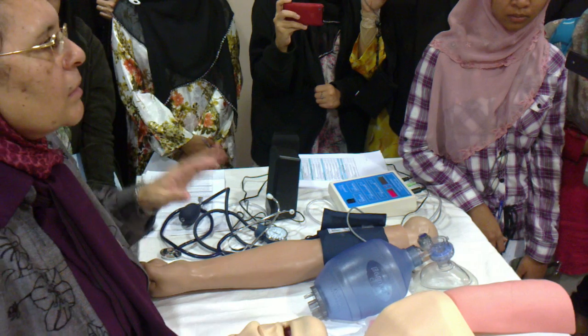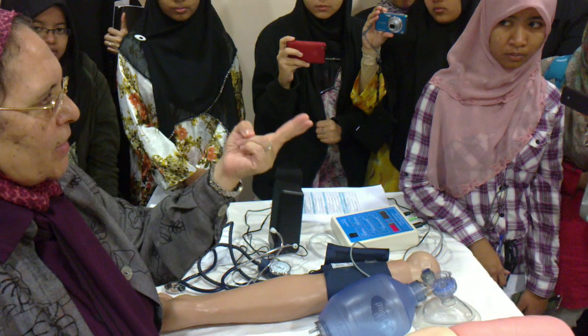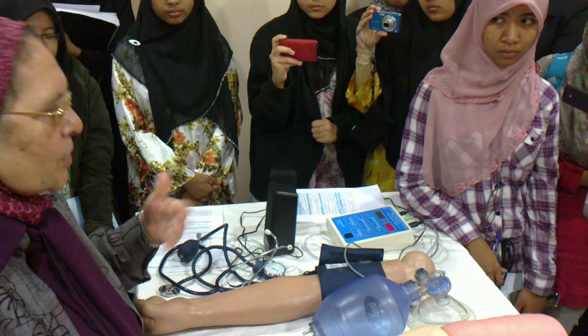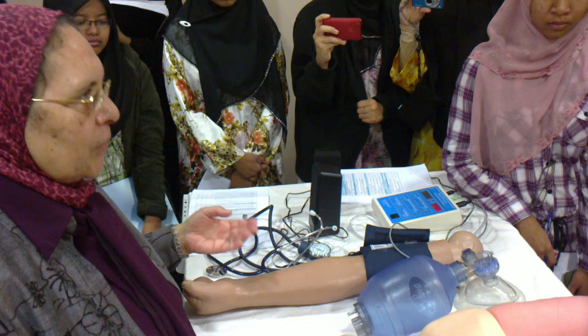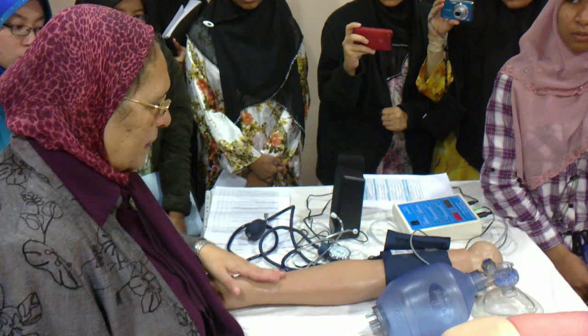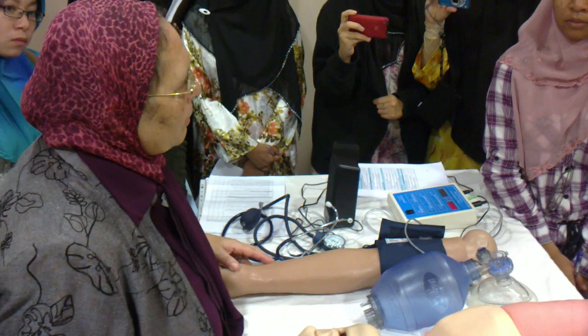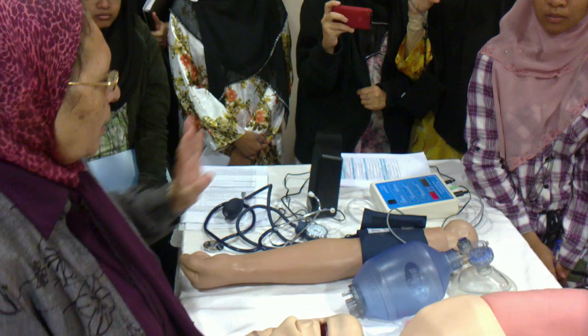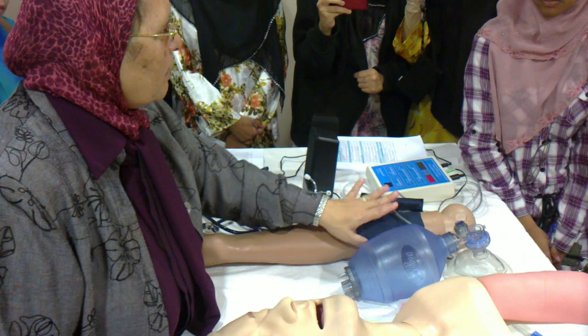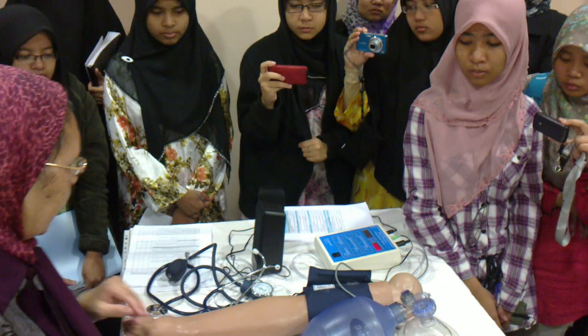If I ask you measure the blood pressure, you have to do pulse, palpatory and auscultatory. First, you introduce yourself to the patient and greet him. Good morning. I am Dr. As if it's your name, and I am going to measure your blood pressure. Okay. Then we will put to you the cuff. We will put it and fix it in the correct manner.